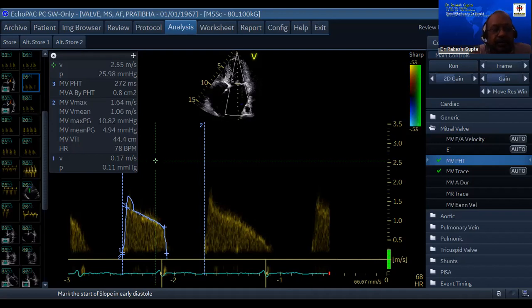Good evening, Jigna. Tell me, you got 5 of these sample volumes. Everybody is talking of 0.8, 0.9, 1, 1.2, 1.3. How do you say what is the area of these patients of mitral stenosis? So first we'll check by planimetry, at the level of the mitral valve, short axis level. We'll trace the mitral valve area. If it is less than 1, it is severe.